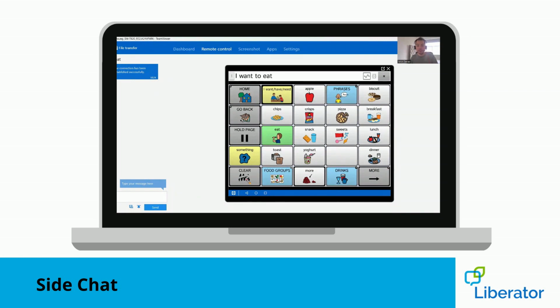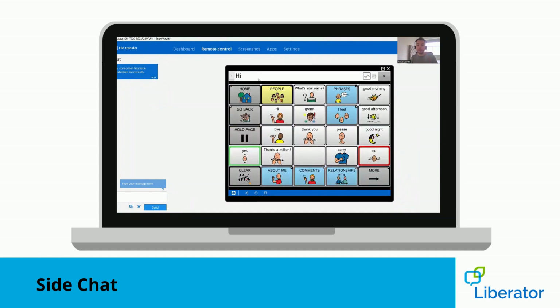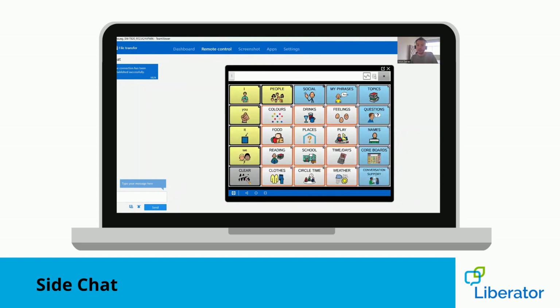I can make my choice. We've already done pizza, so let's do dinner for this one. And again, if I go back to side chat window number 2, it will remember exactly where I was previously. By clearing and going home, that resets them.